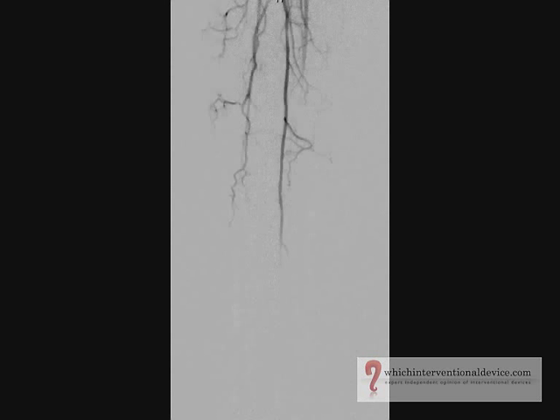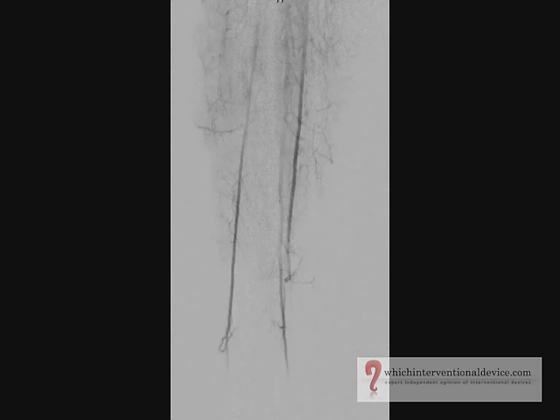Here you can see excellent flow distally with no evidence of distal embolisation following the angioplasty.